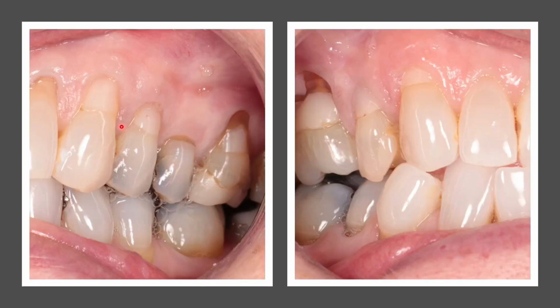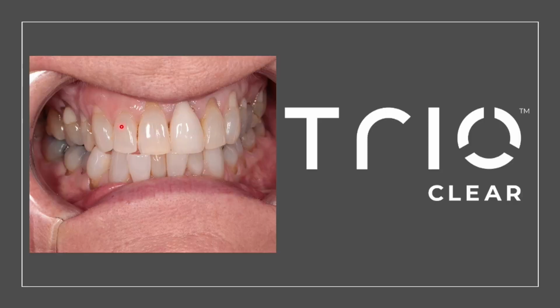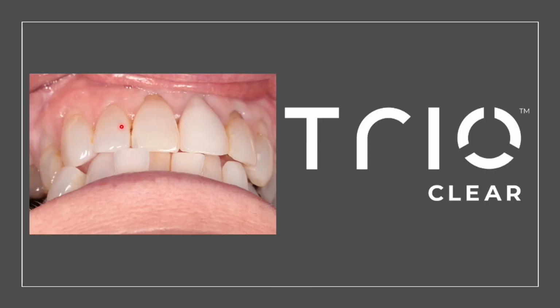We can see this from the right hand side as well. I would describe this case as obviously quite high risk for recession here, and so we don't want to be doing too much with aligners, and that's it from that slightly different angle. It's a fairly significant crossbite actually.